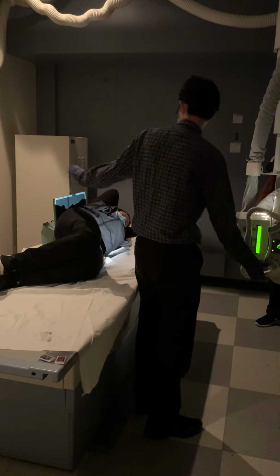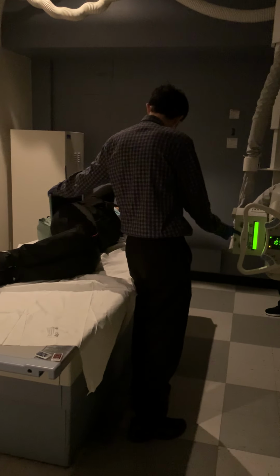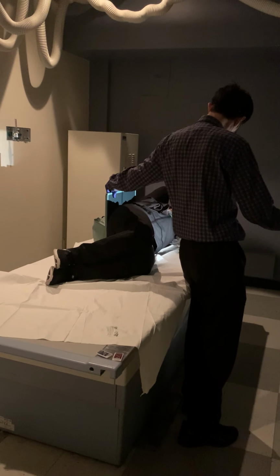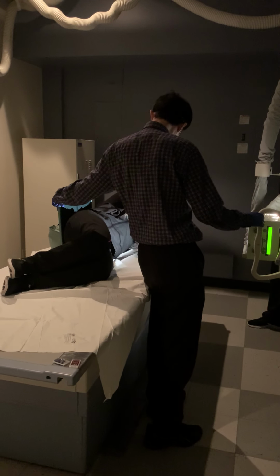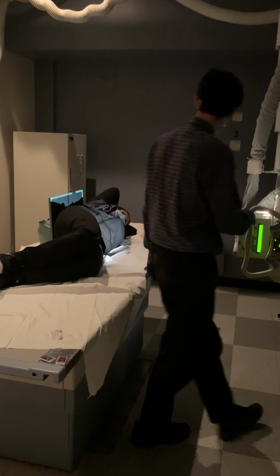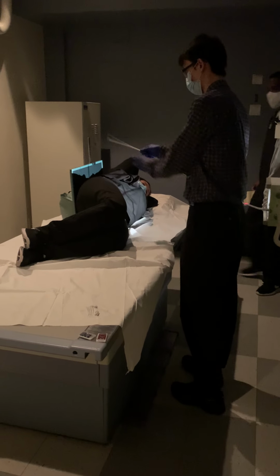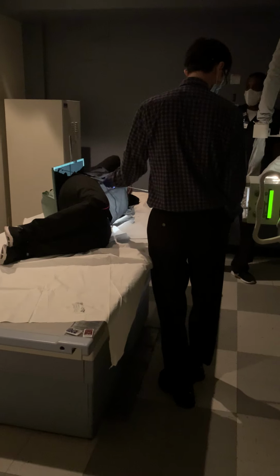my next goal is to line up my image receptor. So, take this, take the white line, put it right here. Too far. Right here where my central ray is, okay? So perfectly lined up to our IR, and now we will check our SID. So how far away are we?